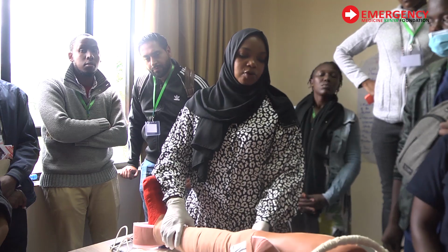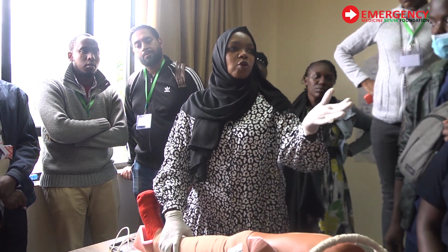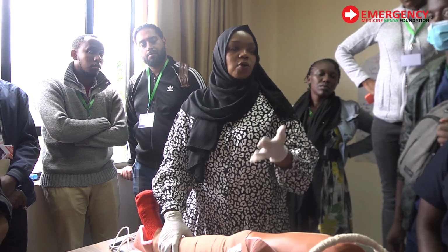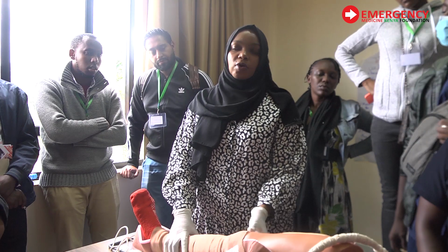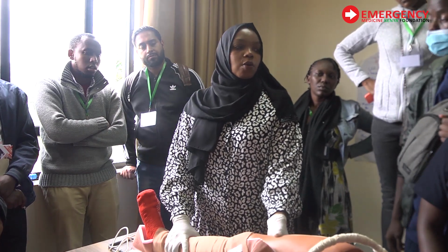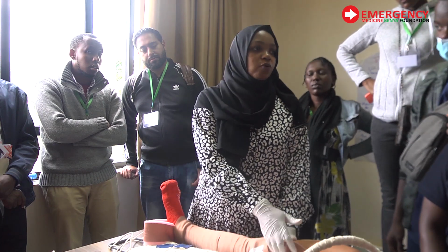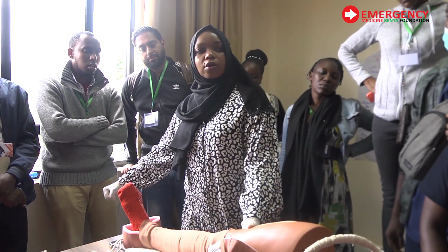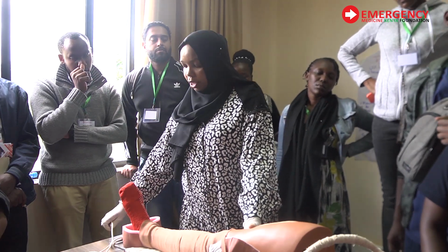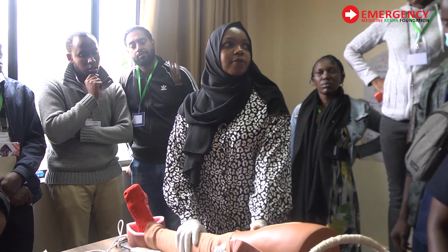It's just a support, because it's elevated. It makes him a bit comfortable. If you have injured yourself, we always tell you, elevate your hands or elevate whatever it is. So it's a good, comfortable thing. Because you cannot pull someone's leg on a firm surface like this. Chances of you forming sores on this area is going to be high. So you need comfort here, and you have a pulley here. So you're doing a skin traction, but this is what supports the leg.